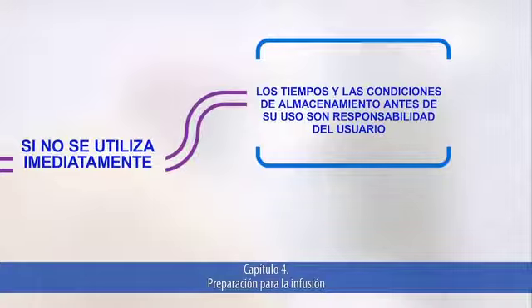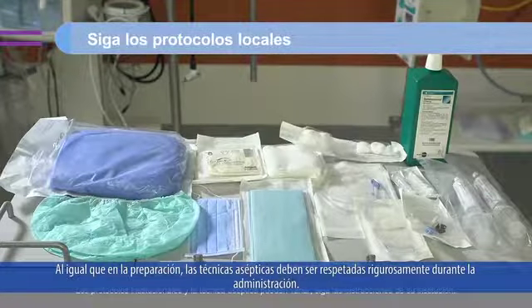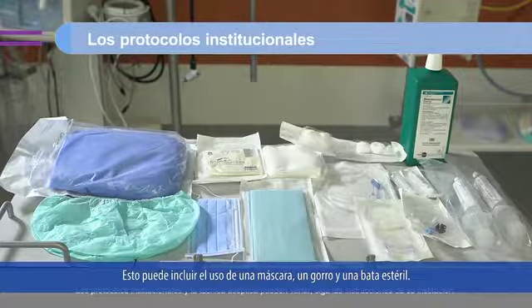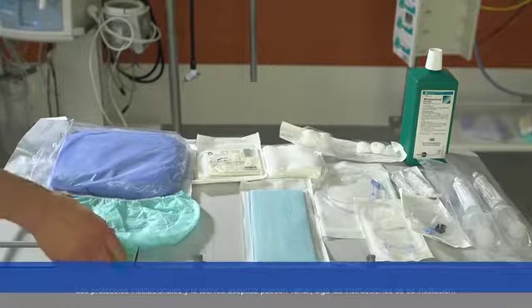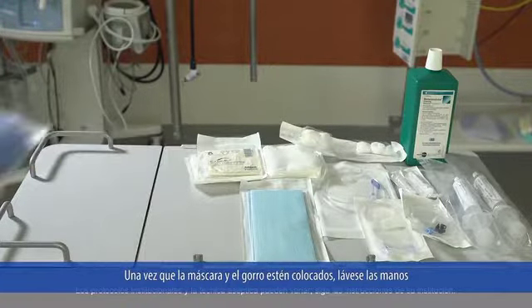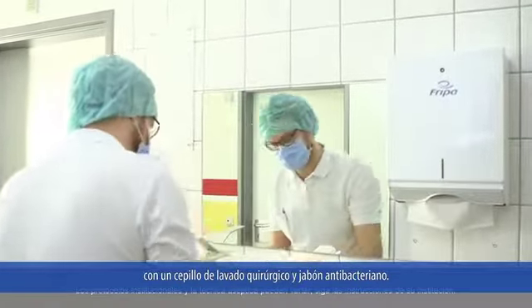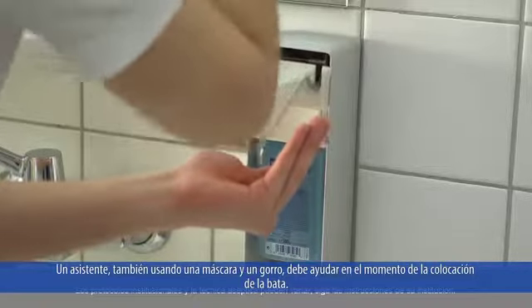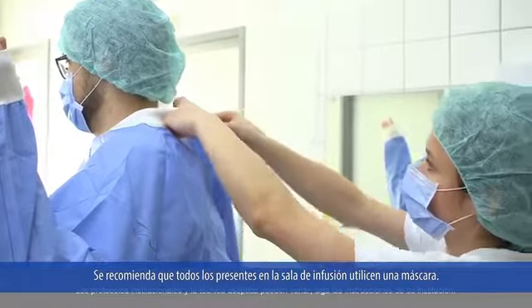Chapter 4. Preparation for infusion. As with preparation, aseptic technique must be strictly observed during administration. Follow local protocols to prepare to administer the infusion. These may include wearing a mask, a cap, and a sterile gown. Once the mask and cap are on, a thorough hand-washing protocol should be followed, using a scrubbing brush and antibacterial soap. An assistant, also wearing a mask and cap, should help with gowning up. It is recommended that everyone present in the infusion room wears a mask.